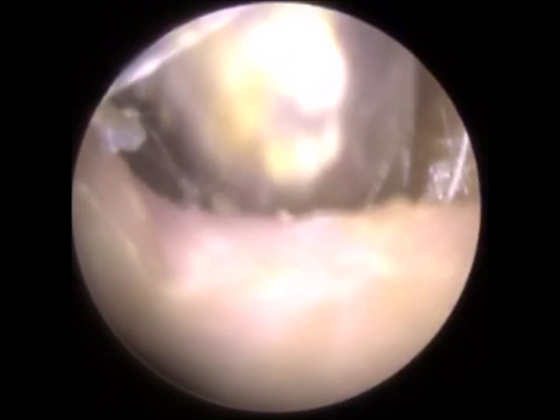You can see how much I'm tugging this. I'm really, really am tugging this. I'm going backwards and forwards, trying to loosen this keratin. And there's a slither of keratin here that I managed to remove using a suction probe. So you can see kind of the halfway house. You can see on the right hand side, that's his original ear canal. And on the left, this is his mastoid cavity. And I'm just working on the mastoid cavity, just trying to release, still working away.